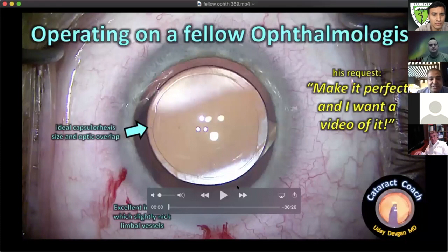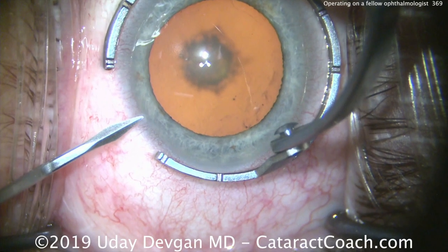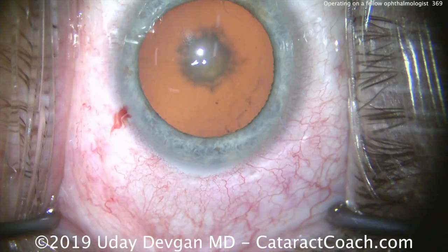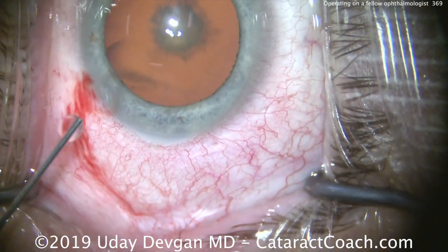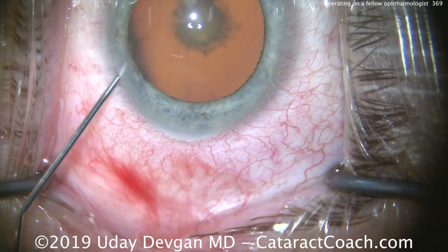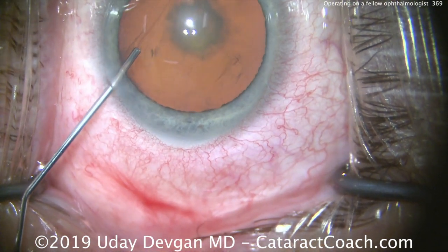All right. So this is just a routine case. But what was different here is this is a fellow ophthalmologist, a fellow cataract surgeon, no less. So the stress here is not actually performing the surgery, it's the mental stress in doing the case. This is pretty much a routine, average, normal case for me. Fortunately, this is just posterior subcapsular, not a posterior polar. If my fellow colleague from down the street had a posterior polar, it'd make it even more stressful.